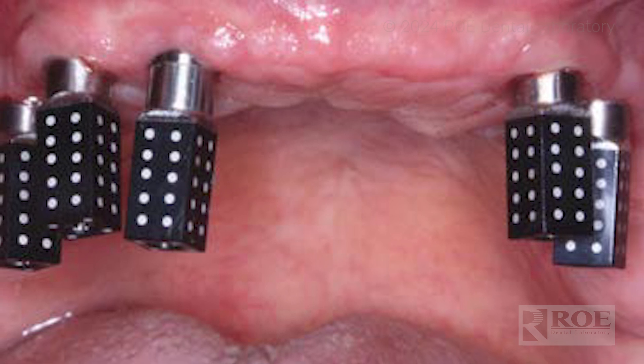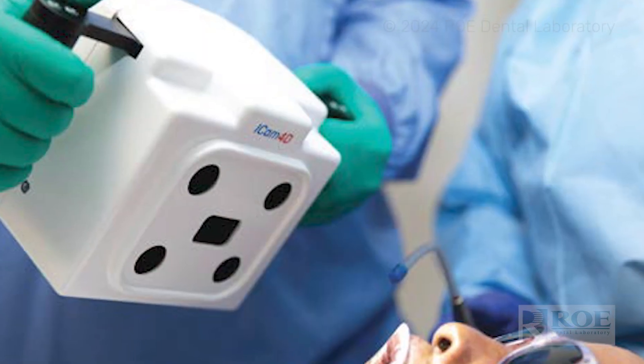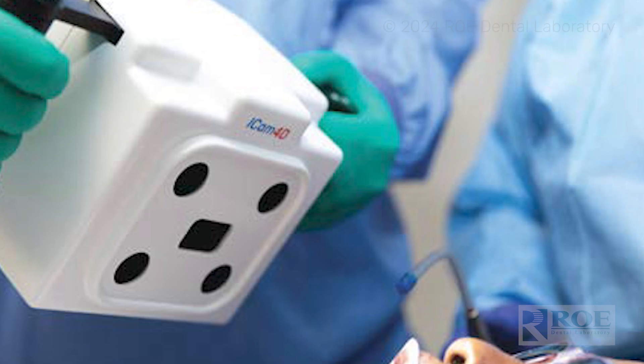First, go ahead and give us a full face, full smile photo of the patient wearing their prosthesis. Next, you're going to remove that prosthesis, seat your photogrammetry scan bodies, and then capture your photogrammetry records, giving us the implant positions and multi-unit abutment positions.